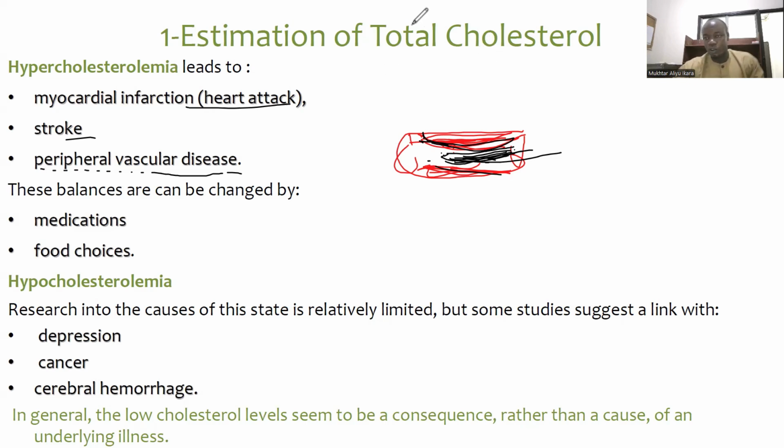So in this video, as we go on, we are going to see how we are going to estimate the concentration of cholesterol in the blood or in the urine.